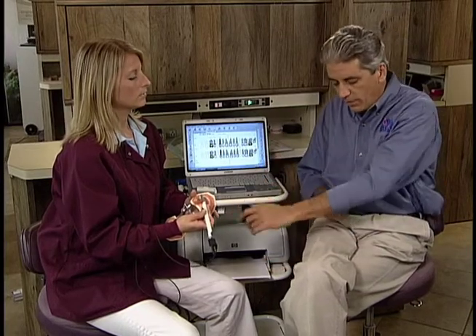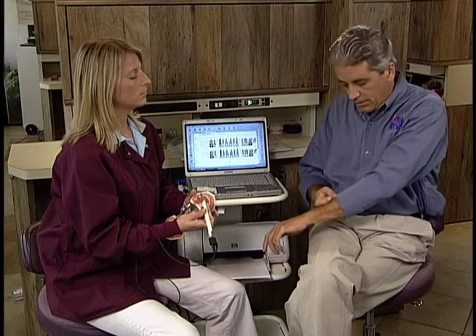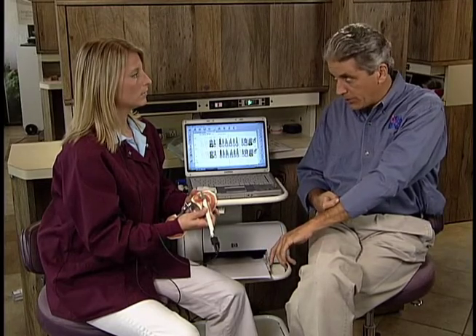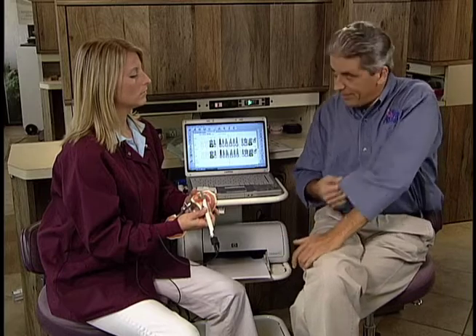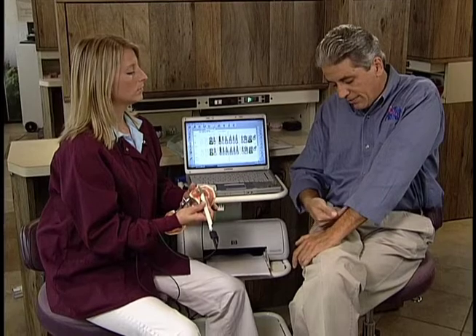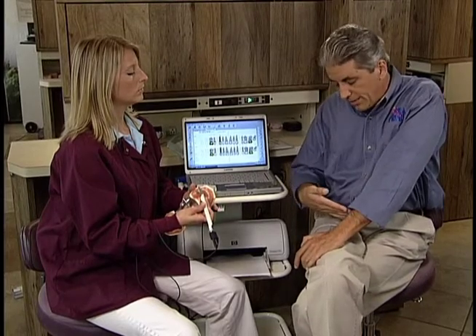When we have a really good tight pocket, we know exactly where to stop that sleeve in contact with the margin. When we have a big, floppy, diseased pocket, we need to stop that sleeve at the same plane, which is where you took the measurement with the traditional probe. It's visual acuity to stop there.